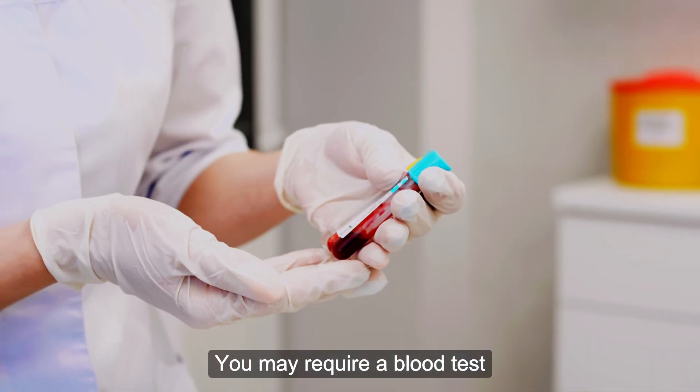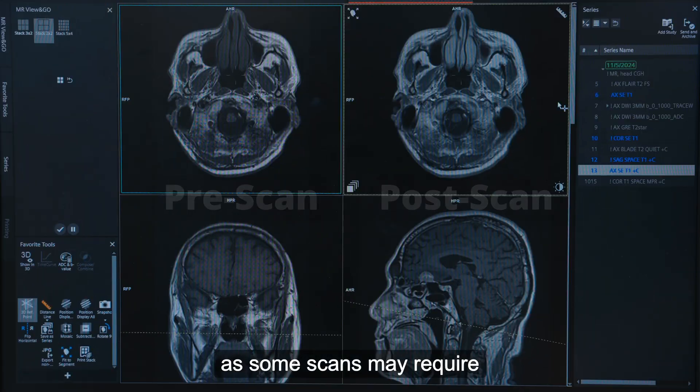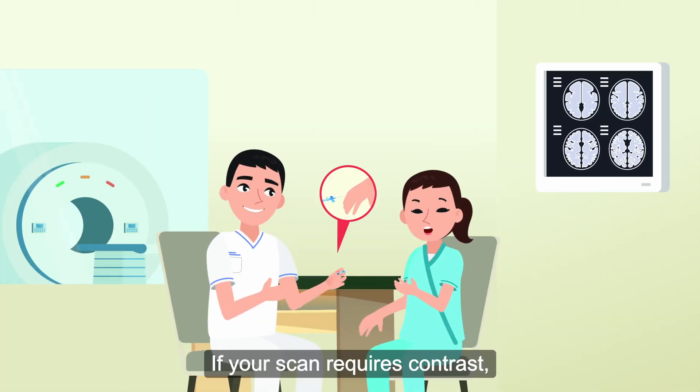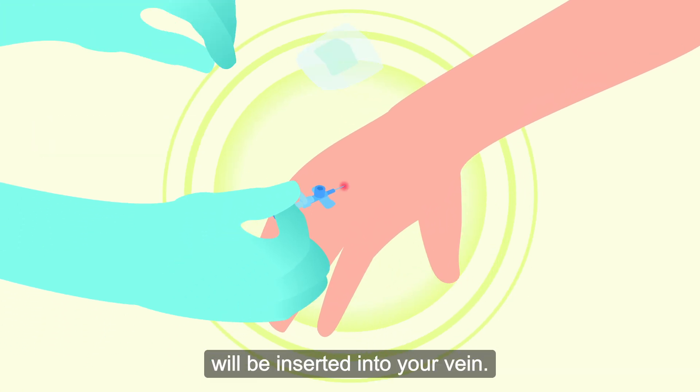You may require a blood test to examine your kidney function before the scan, as some scans may require gadolinium contrast. This is a special type of dye used to identify some structures more clearly. If your scan requires contrast, an intravenous plug will be inserted into your vein.